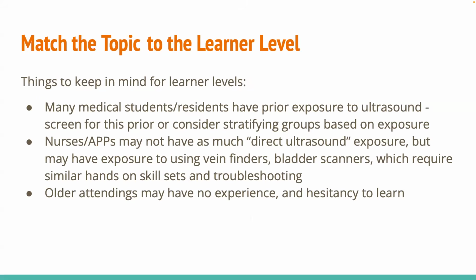So some things to keep in mind for the different learner levels that I've personally seen, and some of my ultrasound friends have also seen, is that a lot of medical students and residents and fellows at this time have some prior exposure to ultrasound. So if you're doing a medical student, resident, or fellow-based workshop, it might be worth screening what their knowledge base is prior and stratifying your small groups based off of their exposure.